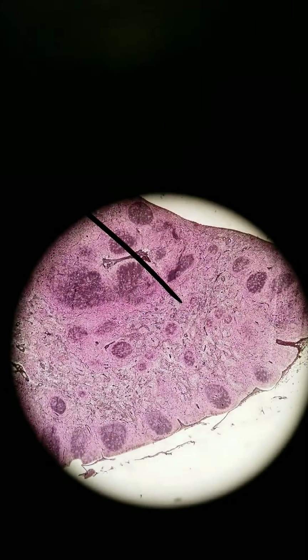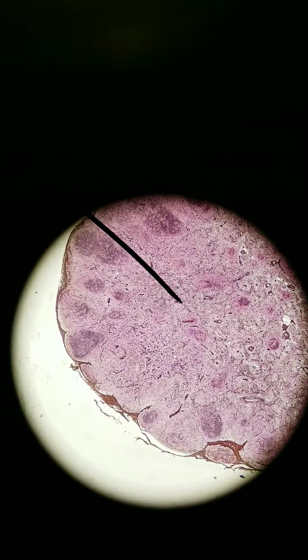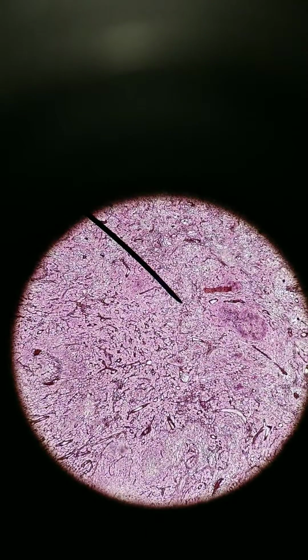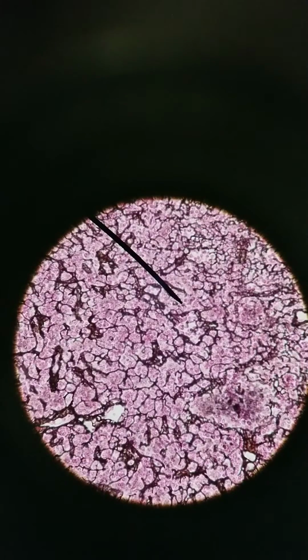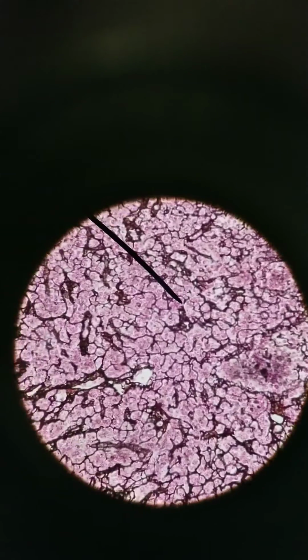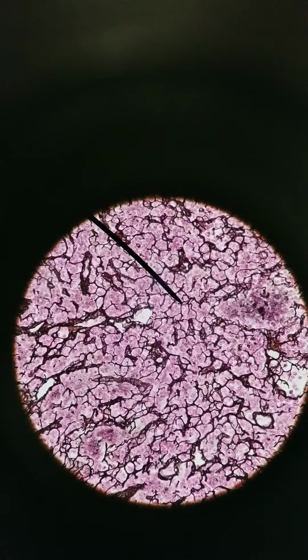There we go. We're actually looking at a lymph organ here, but I'm going to look deeper in that lymph organ. This is at 40x total, 100x total, 400x total. And we can see how there are lots of dark branched lines in between the lighter stained nuclei.